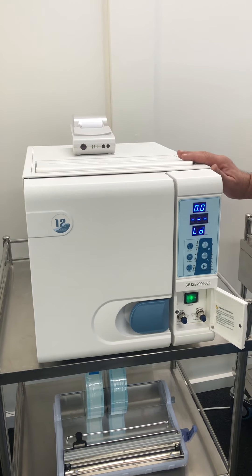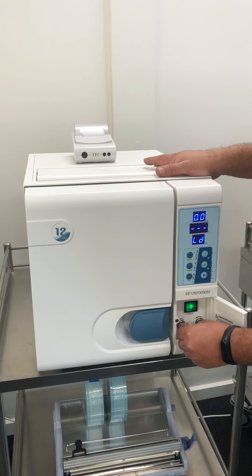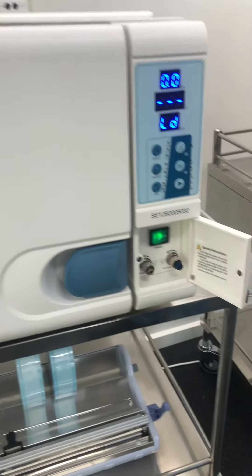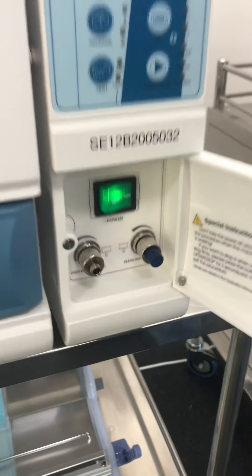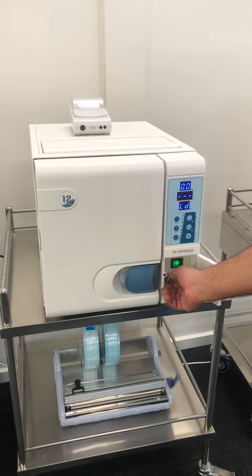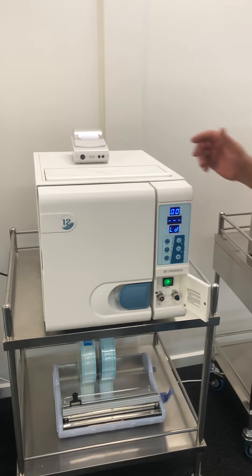Please try to make a habit of every time you top it up with distilled water, put your draining hose onto the edge of the used water tap, turn it anti-clockwise and empty out your used water. Try to make a habit of that.